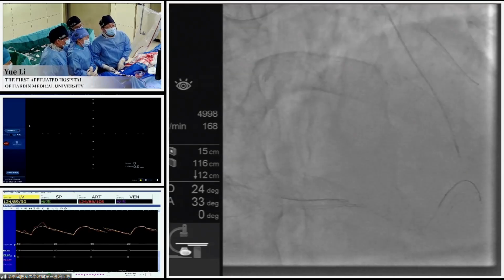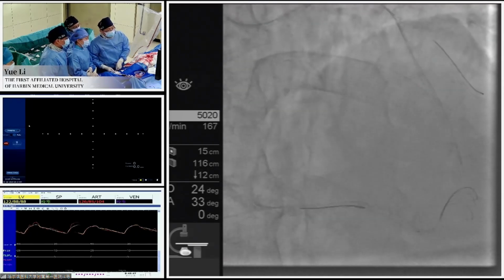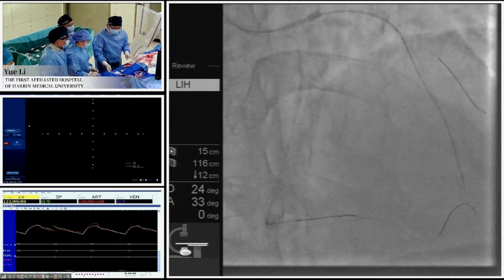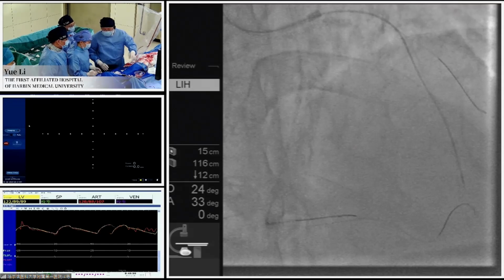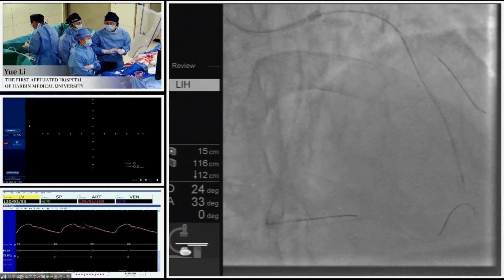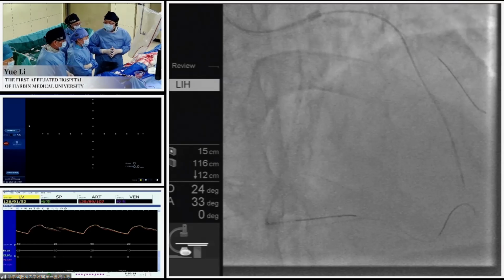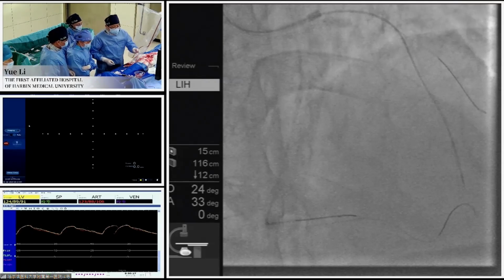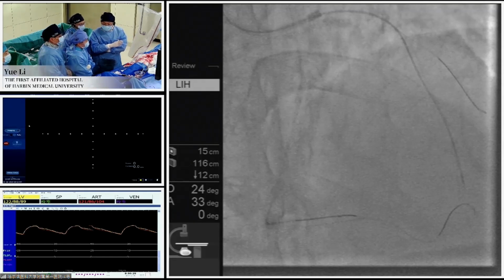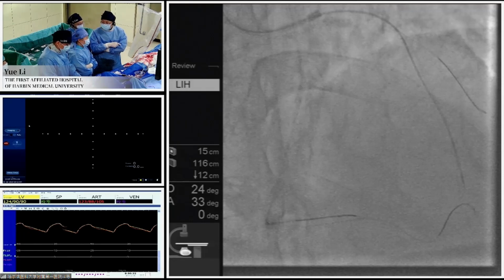So at present, as we know, we have many methods and many kinds of microcatheters and wires. The success rate of recanalization is pretty high, but what we should pay attention to is the quality of the recanalization. Try to avoid long-segment subintimal wire crossing, subintimal stent implantation, avoid side branch loss, avoid periprocedural myocardial infarction. This is what we should do. For this purpose, imaging guidance is very, very important, like the intelligent visualization system software we made.